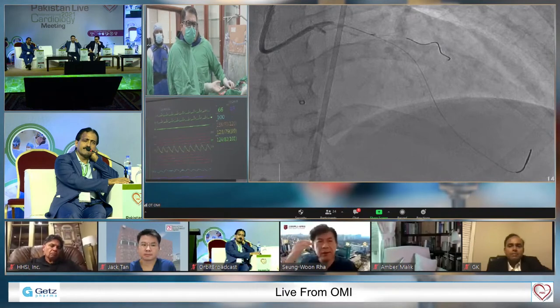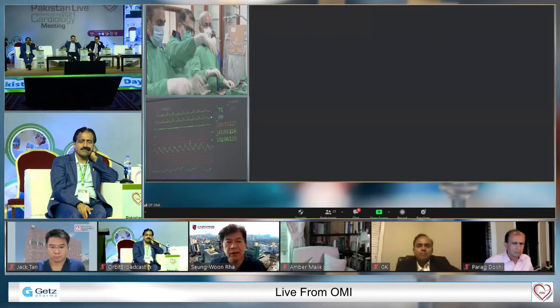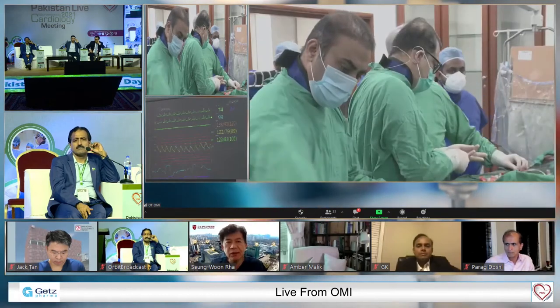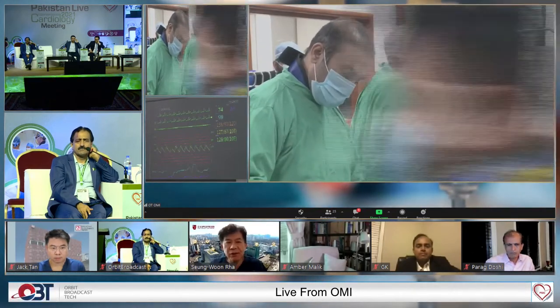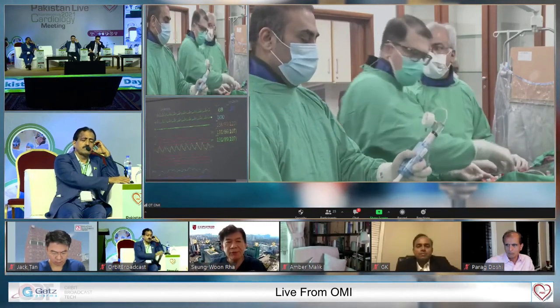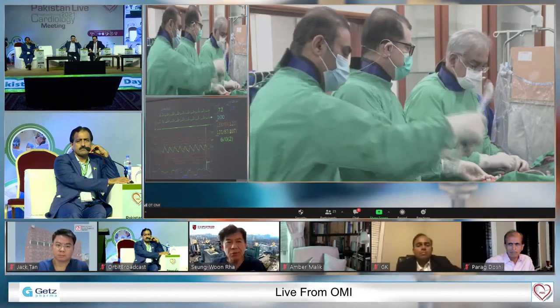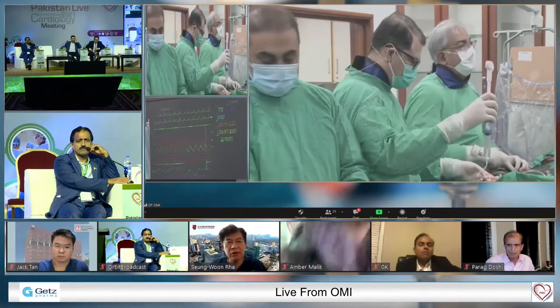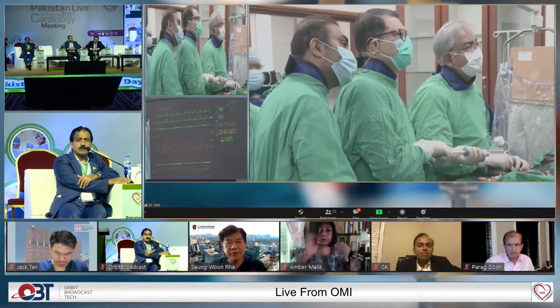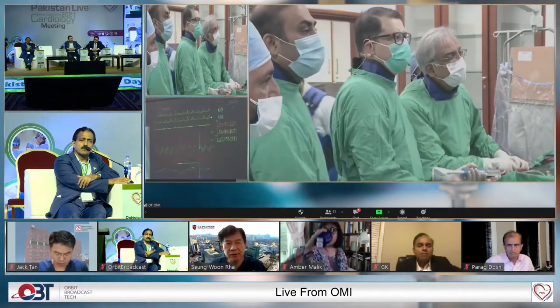Hello? Yeah. Because in this case we have to be concerned for the side branches from D1, D2, D3. And because there's a moderate to severe disease in the proximal LAD, to minimize flow limitation from the proximal disease, I would prefer a slender microcatheter. Fine Cross is one of the options, but I would prefer Caravel. Then I would choose Fielder first. If Fielder fails to cross, then I would try the directional control wire, an escalation wire, second. That is my usual practice. And if that fails, then we can do the very nice retrograde collateral from the PLB to epicardial from PLB to the distal LAD. Thank you.